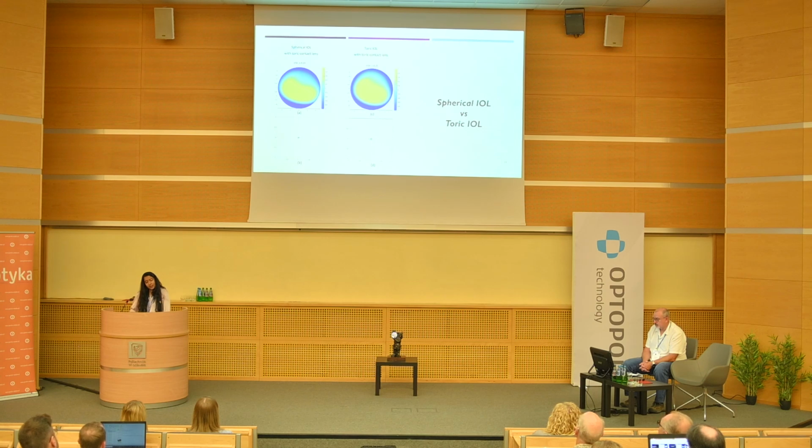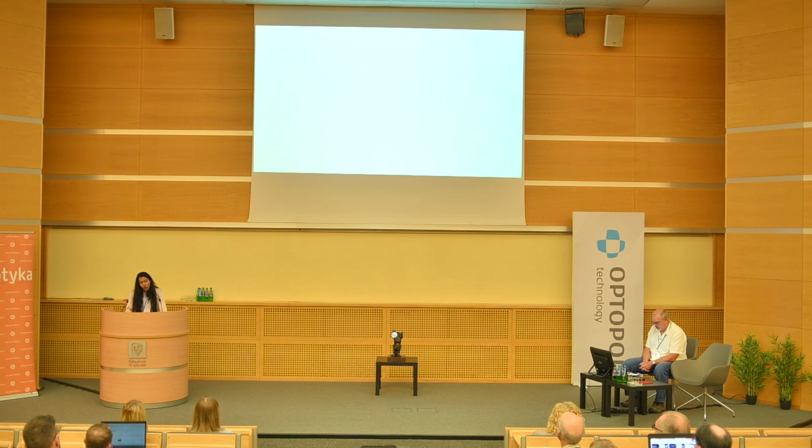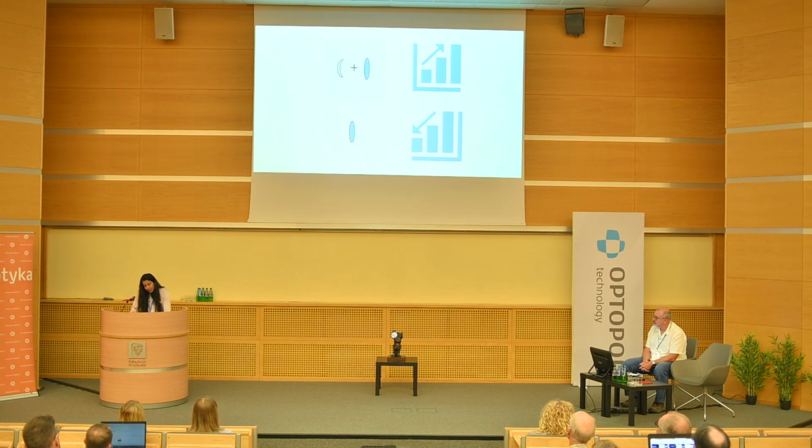That's the reason when it comes to toric IOL and toric contact lenses, a slightly lower VSX can be seen in the comparison between the wavefronts. So altogether, the contact lens plus IOL corrections give a better VSX compared to the IOL corrections, again mainly because of our RGP contact lenses being apt for the keratoconic eyes.